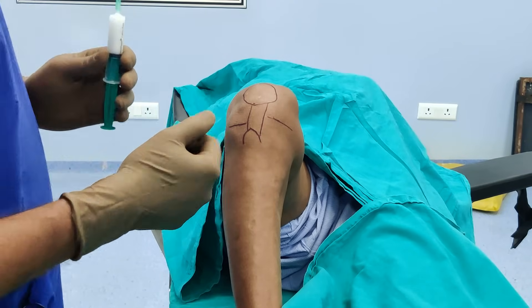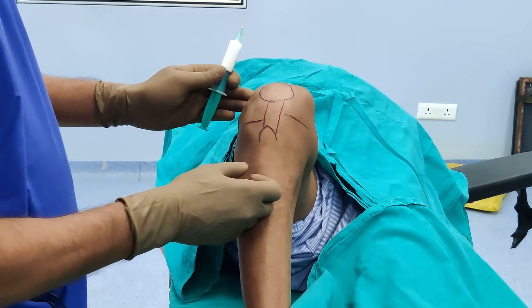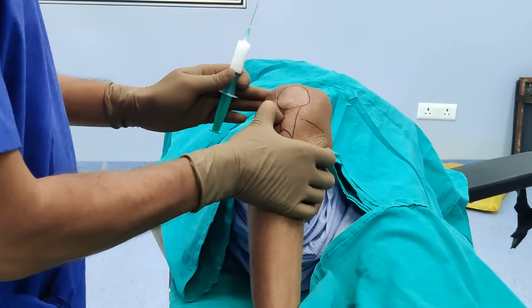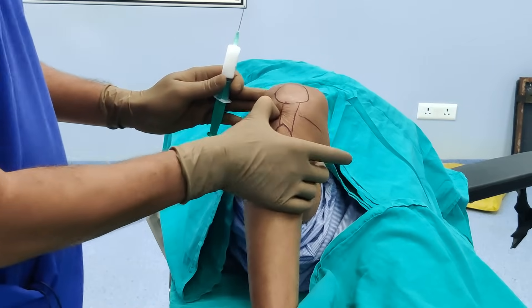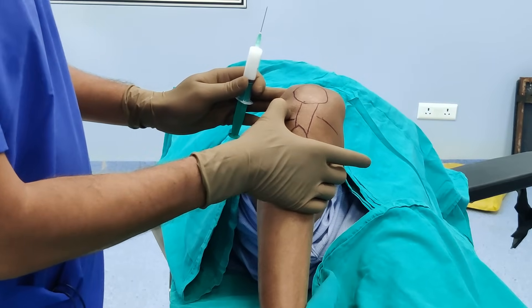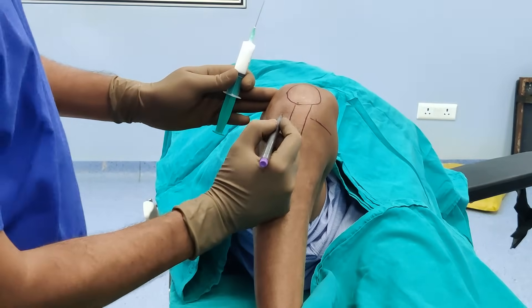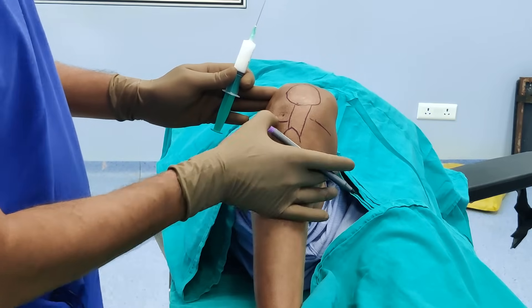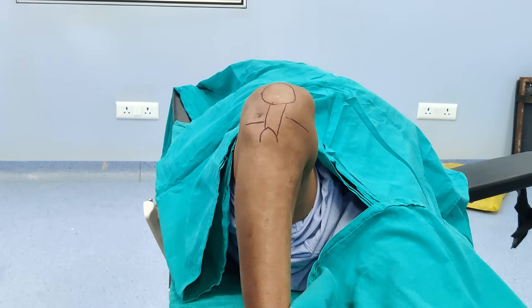Once you have marked these landmarks, if you do arthroscopy, this injection site is the same as your anterolateral portal. Just go up roughly a centimeter above the joint line and a centimeter lateral to the patella tendon — so a centimeter up and a centimeter here, just roughly. This is where you will find the soft spot, and this is the site of your injection entry.